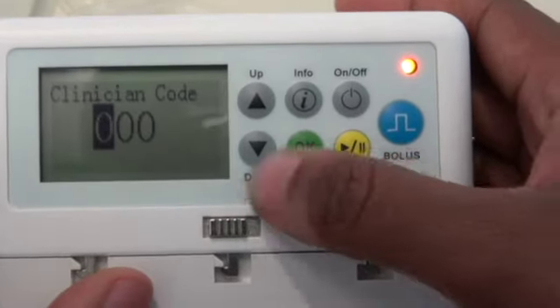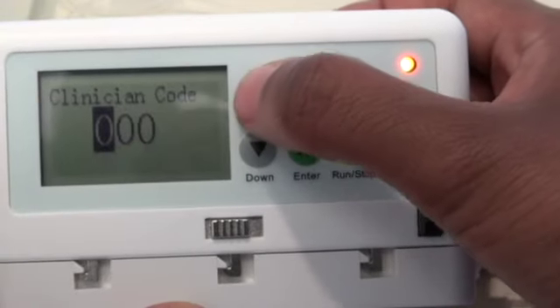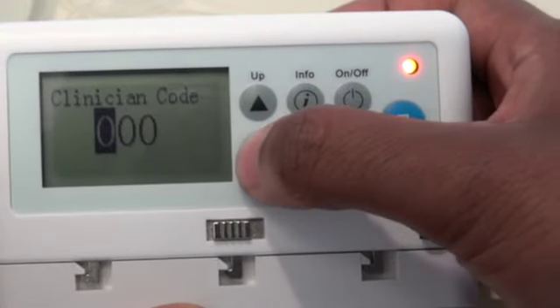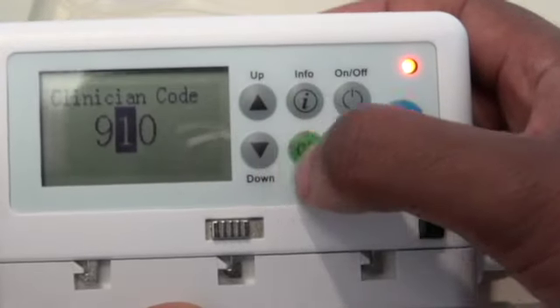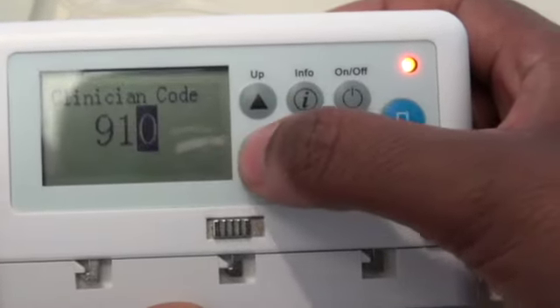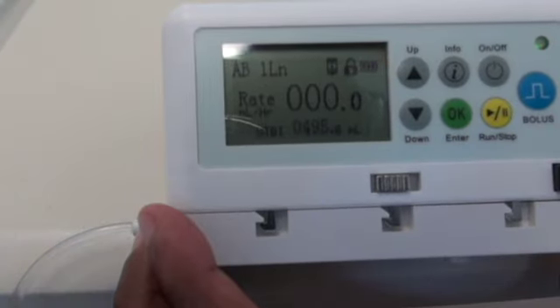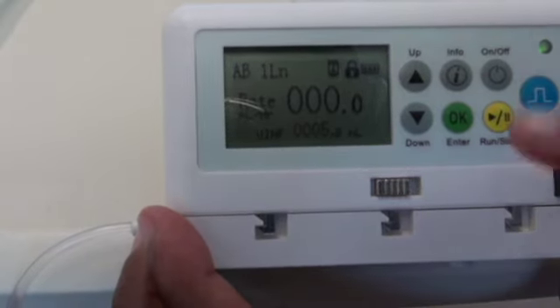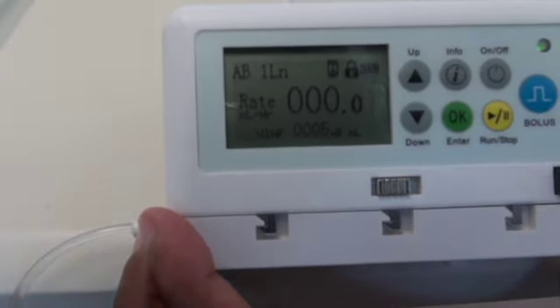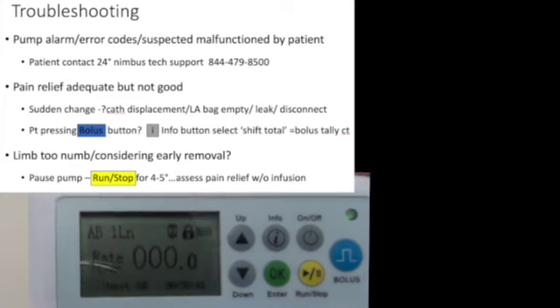Press OK to confirm. The clinician code is 919 — you can use the up and down buttons to enter each number and press OK for each digit. Once the settings are confirmed, press run/stop to start the infusion.